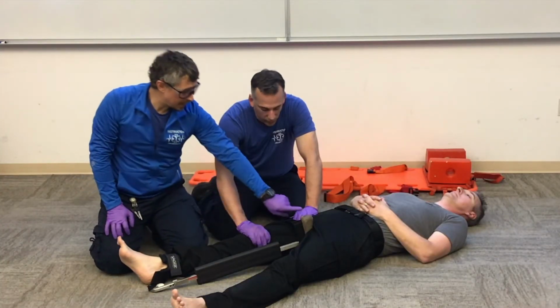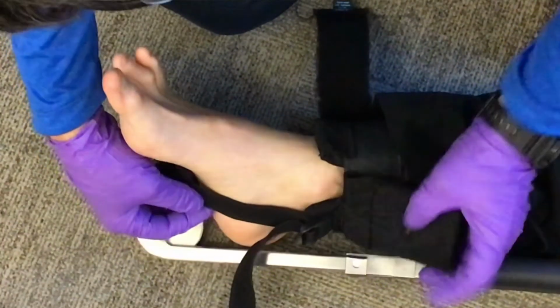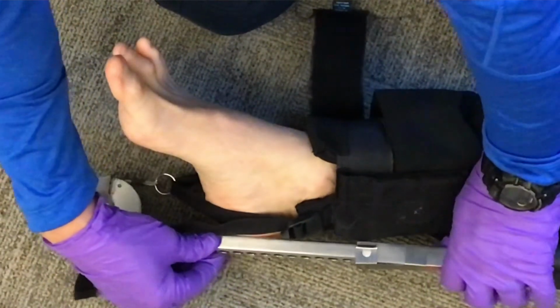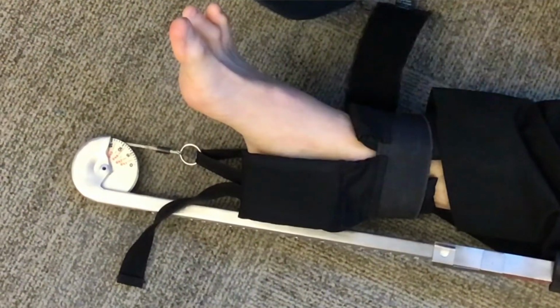Now that we have our device high and tight in the patient's groin and our ankle hitch secure, we'll put one hand on the upper shaft, one hand on the lower, and pull them apart. That's going to pull our traction.